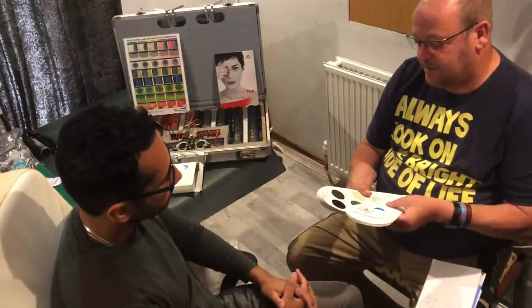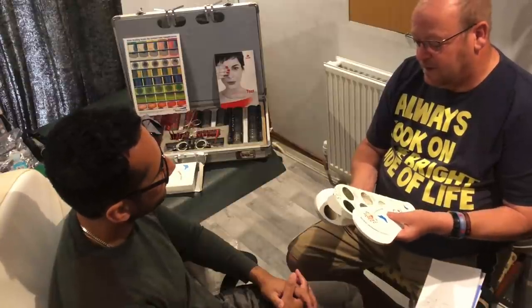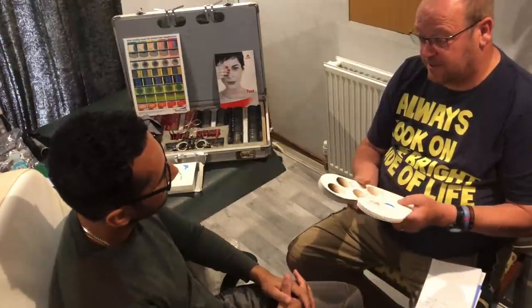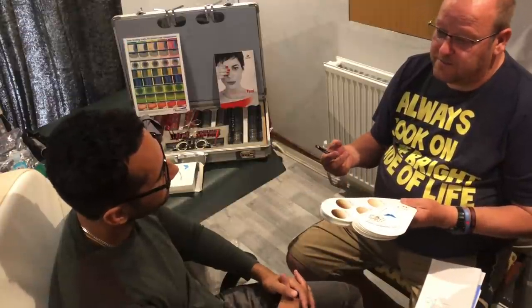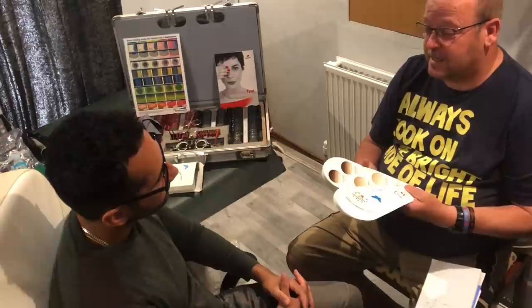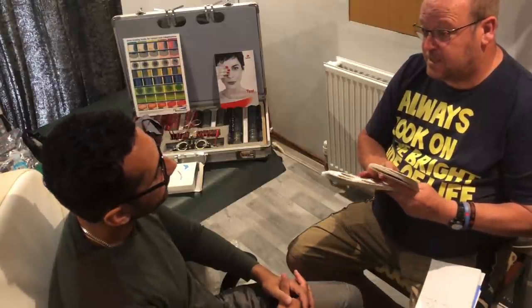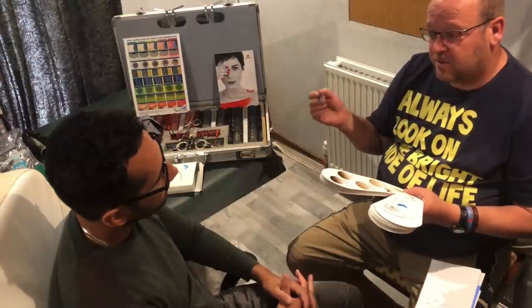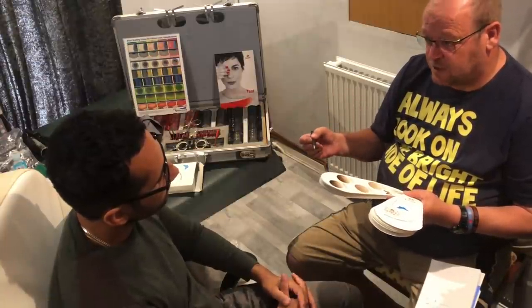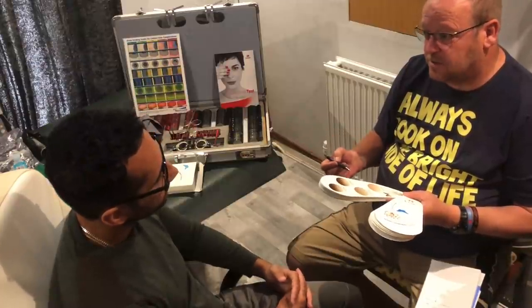So you didn't expect there to be so many colours, did you? No, I just thought it was brown, grey, pink. Well, the most common effect is brown and grey. You've heard the saying 'rose-tinted lenses.' I'm going to come back to browns now, but this time these are graduated tints. When you're looking through the top of the lens, that's a much darker lens. As you're looking through the bottom of the lens, it's much lighter in colour.